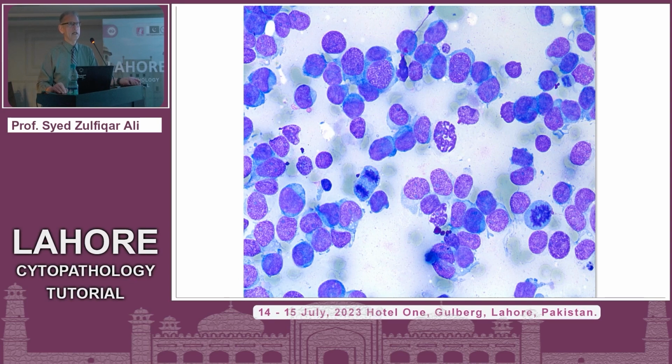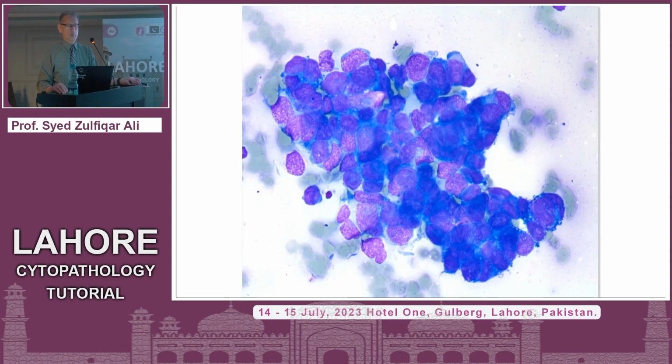So are we done or more? So that's the last one I want to show in DiffQuick. So what do you think is the diagnosis? Lymphoma, absolutely. Out of respect, you're agreeing with me that I sent it for flow, so maybe I appreciate that.